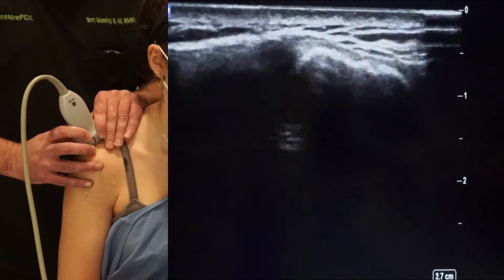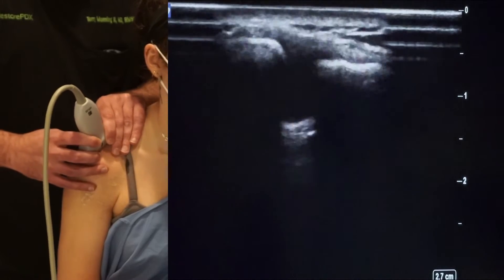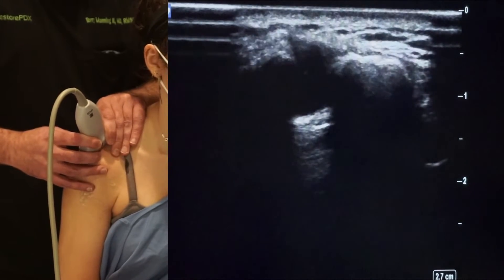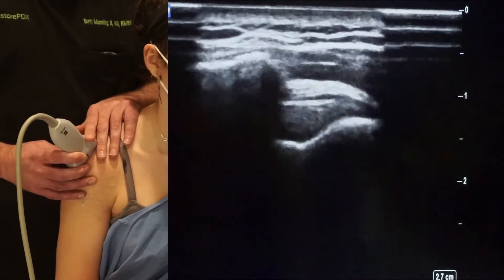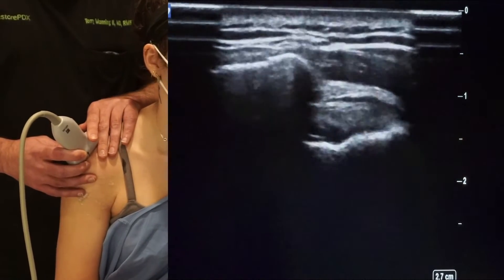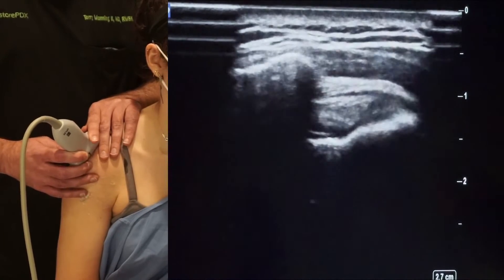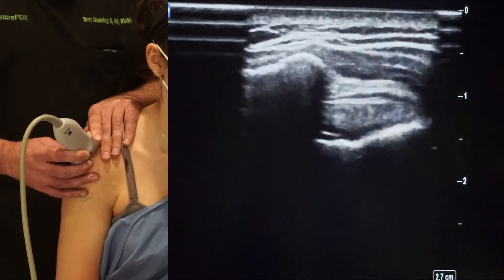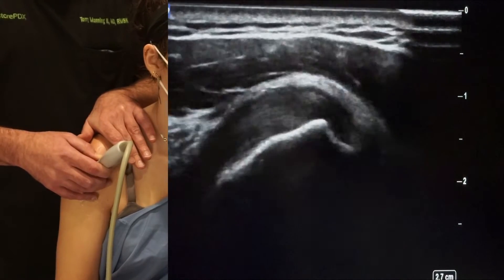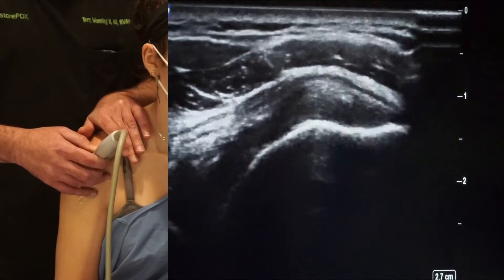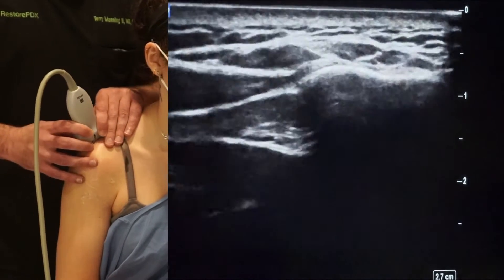This is a nice normal healthy shoulder, but in clinical practice you may be examining a shoulder with multiple potential diagnoses — frozen shoulder, bursitis, supraspinatus tendinopathy or tear, or calcific tendinitis. With ultrasound, you can evaluate the rotator cuff in high resolution and come to a point-of-care diagnosis quickly without needing further imaging, which can help you accelerate your treatment plan.